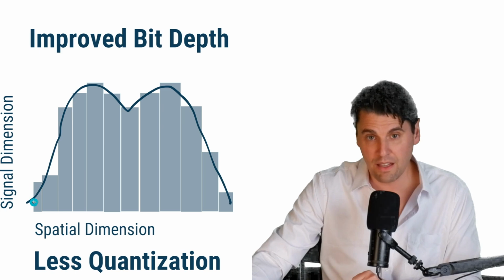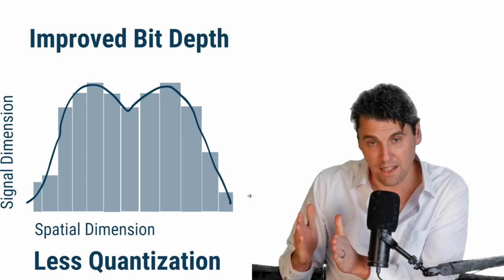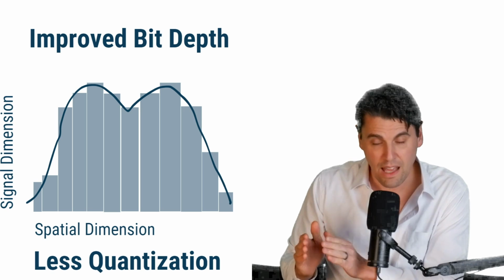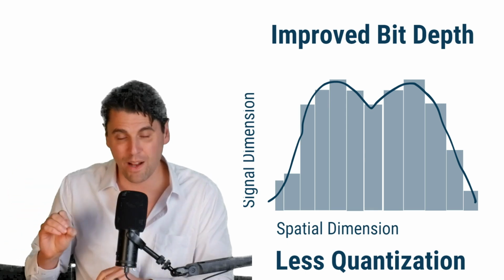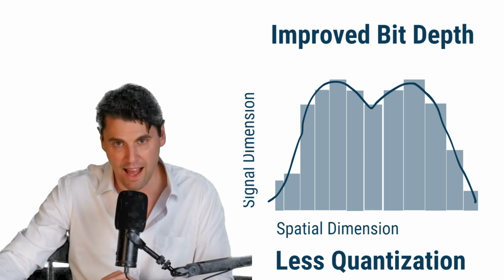Now you can see we can actually relatively well represent the signal here because we have a fine enough resolution to do the measurement, and we also have enough bit depth. So we have less quantization error when we have this higher bit depth.